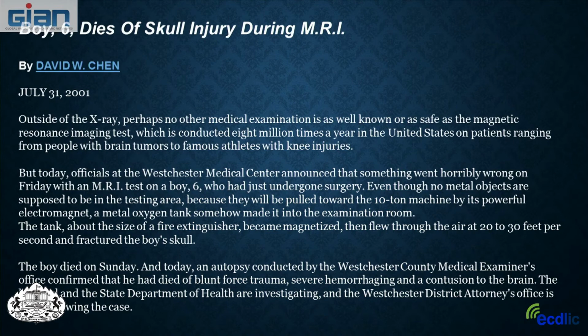A metal oxygen tank somehow made its way into the exam room. The tank, about the size of a fire extinguisher, became magnetized and flew through the air and fractured the boy's skull as he was having this scan. So the boy passed away. This was a big wake-up call to a lot of the people who worked in MRI about how dangerous this missile effect can be.